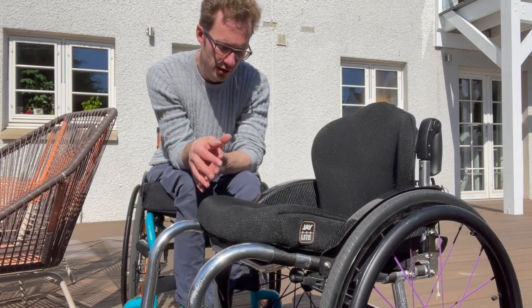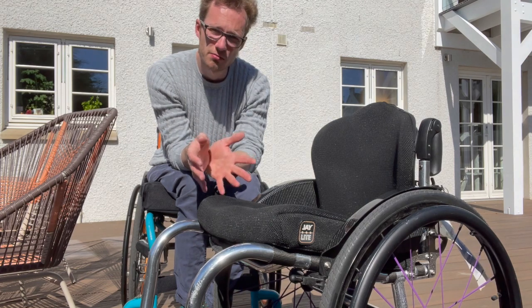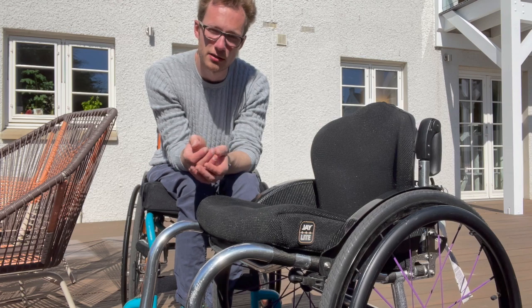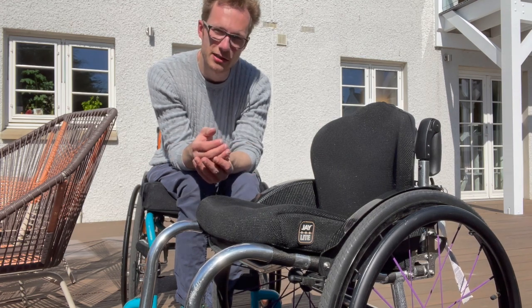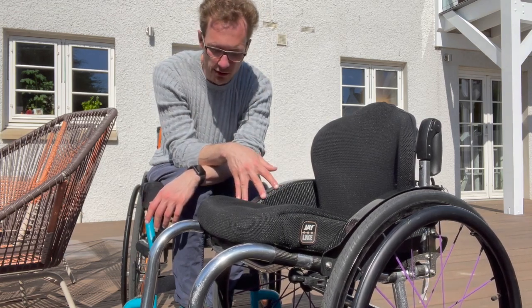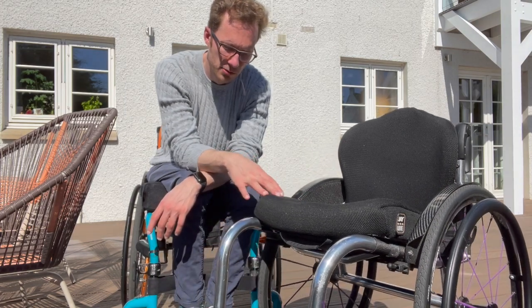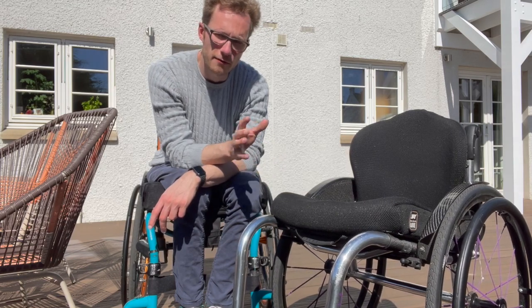Those are the pros of the chair — I'm mostly really happy with it. It's agile, it's light, it's comfortable, and it's pretty much all that I want in a chair at the moment. In terms of cons, cost has to be the main one, but with any custom-made chair that's the inevitability you have to face. Unfortunately with all disability equipment the cost is very significant.